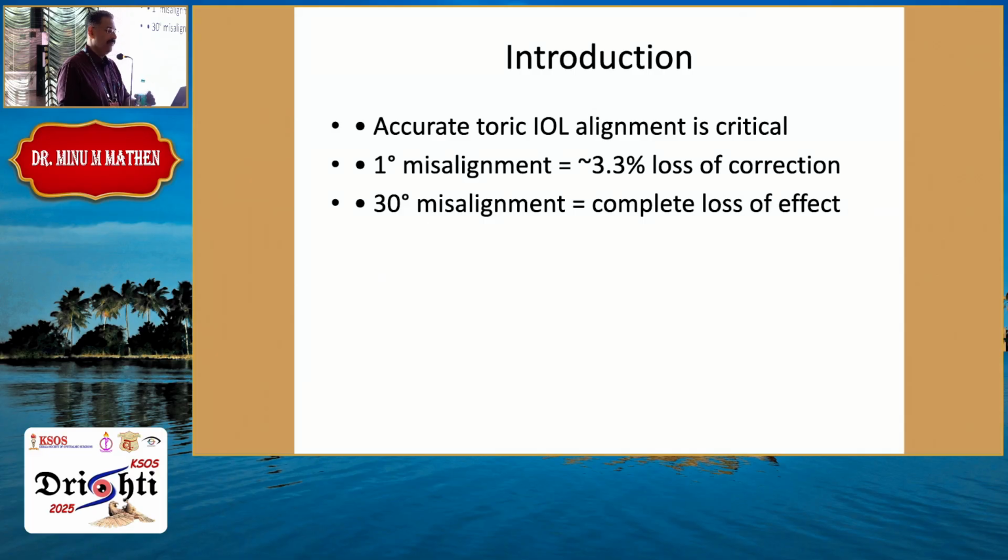So everybody knows this, but still we should realize that this is not that very strict. A little bit of misalignment of 5 degrees here and there actually doesn't matter post-op. We have noticed, I have always been checking. They don't exactly fall at 173, they'll be a little 178 or 168 or something like that. But still they don't accept much of a cylinder. So don't be too finicky about this, but then we have to.